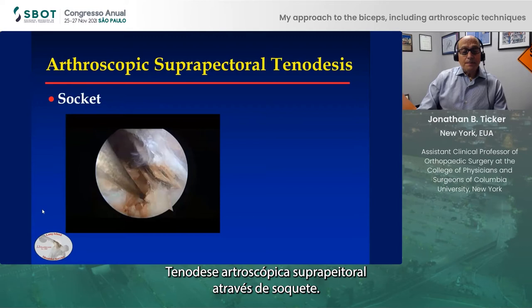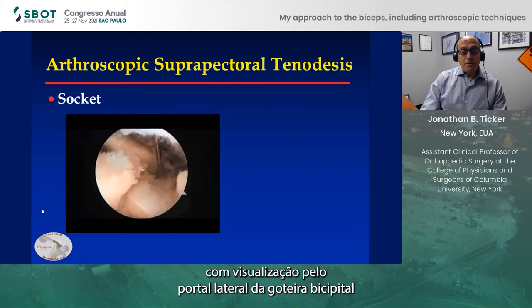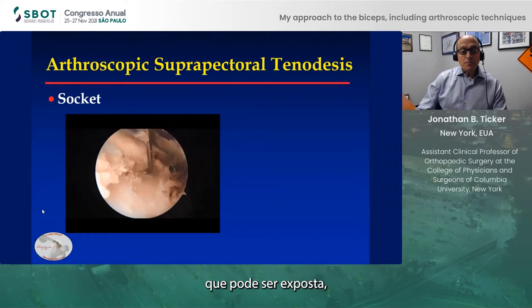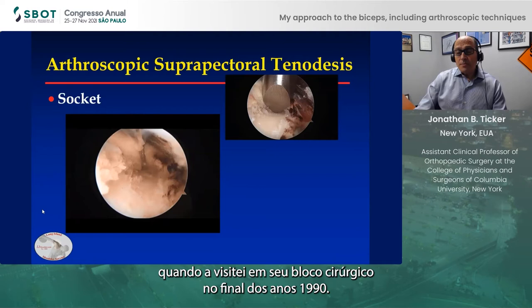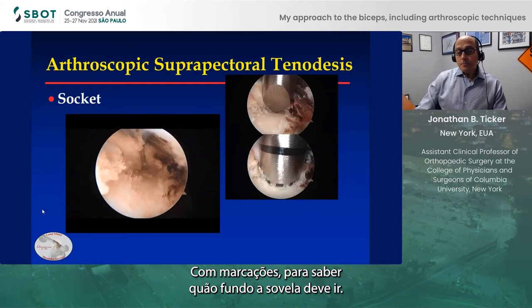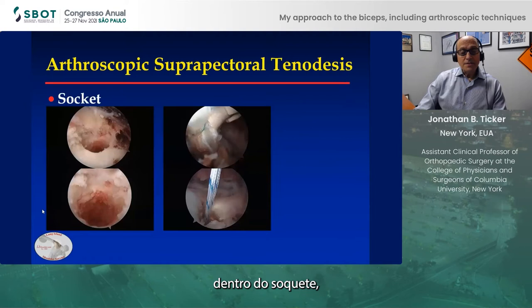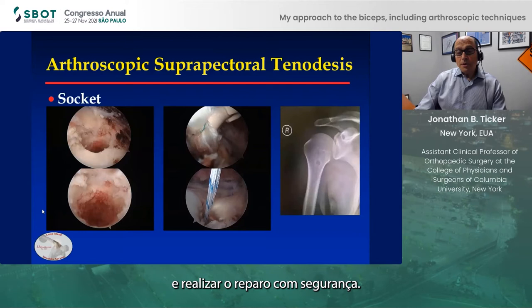An arthroscopic suprapectoral tenodesis through a socket — this is a right shoulder where we're looking from the lateral portal down the bicipital groove to the suprapectoral region, which you can expose below the lesser tuberosity. I'll use an awl as opposed to a reamer, which I learned from Gilles Walsh when I visited in the OR in the late 90s, with markings to know how deep the awl is going. This allows me to compress the bone in a nice socket and then implant the biceps tendon for a secure repair.